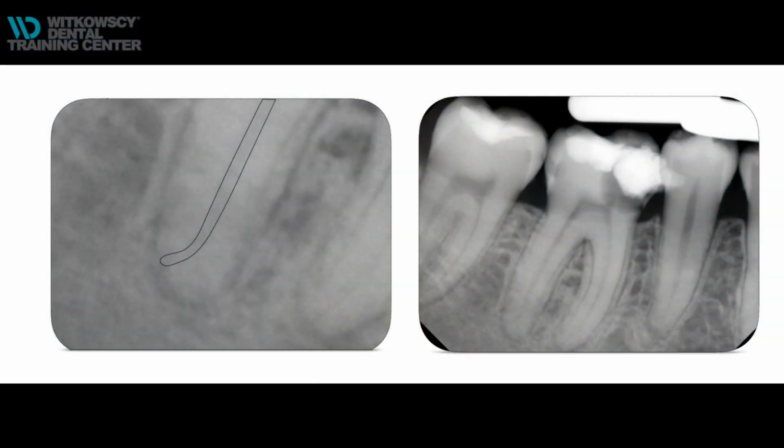If it created the wrong path, the problem is that I not only created a ledge, but I created a perforation in the apical area. So when we look again at this X-ray and analyze this situation, the only thing which helped me and saved me from total failure was proper irrigation and proper activation of the fluid.